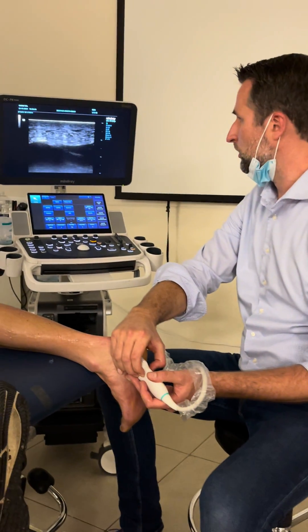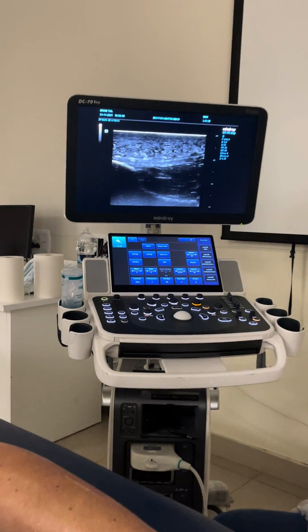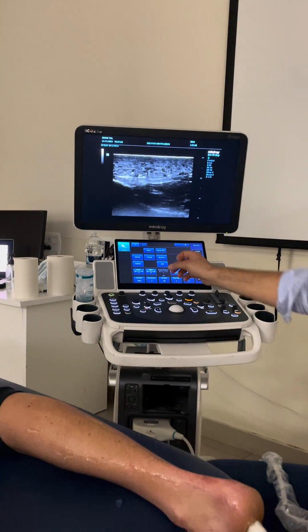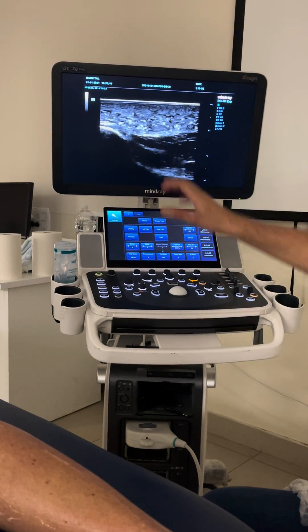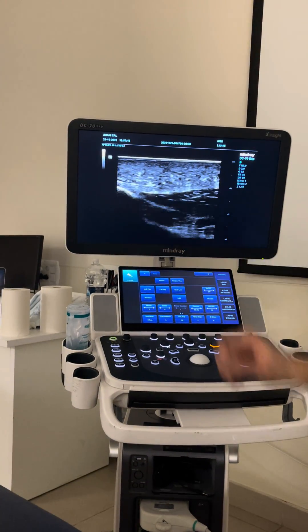As for the settings on your machine, you have to scan through the fat pad, which means there is a lot of scattering and a loss of signal. So preferably you try to go on a lower frequency. The image is going to be less clear, but it's going to give you more information at depth.